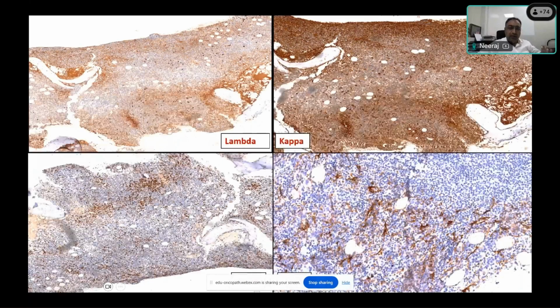So now you are able to see the CD20 positive cells, and sometimes looking at the intensity of the stain, just like in flow cytometry, you are able to see the intensity of the CD20 and CD38. Here, a variegated CD20 or a variegated heterogeneous CD38 helps you suspect that probably you are dealing with a lymphoplasmacytoid lymphoma, because you have lymphocytes, plasma cells and lymphoplasmacytoid cells, each having varying intensity of CD20 and CD38.